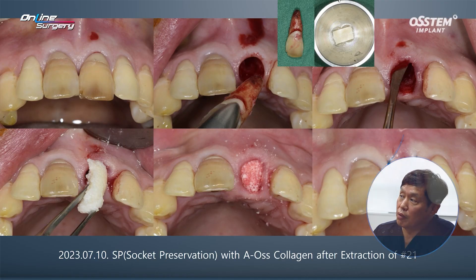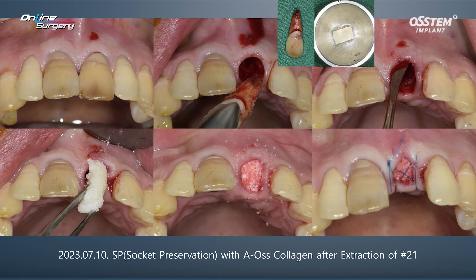Here, you can see the post-extraction condition. Number 21 appears slightly extruded compared to number 11. During extraction, since there was calculus all the way up to the apex, it was removed.